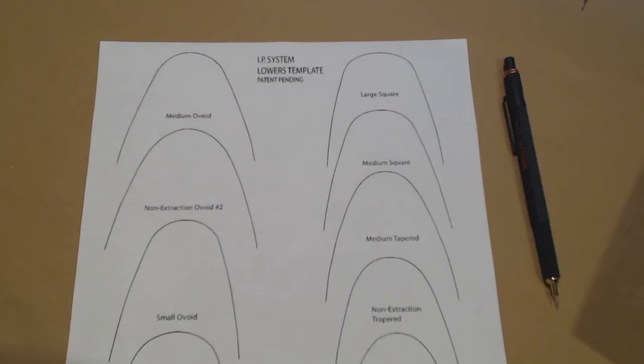The purpose of this video is to demonstrate how to reshape an arch wire without instruments, just using your fingers. This is possible on round stainless steel wires with relative ease. This round stainless steel is your normal finishing wire, or you would use 18x25 heat activated niti wire, but that heat activated wire is not very easy to shape like stainless steel is.